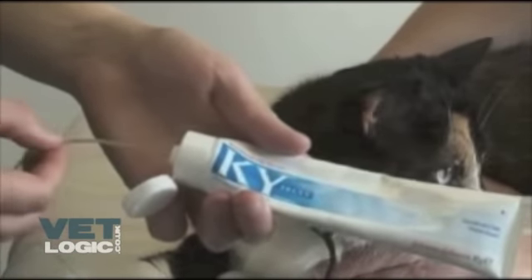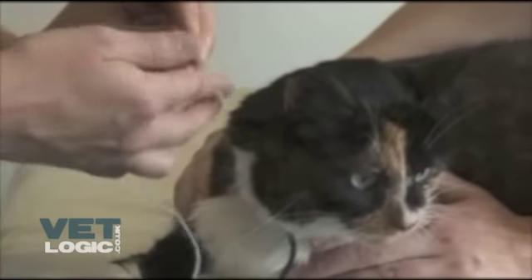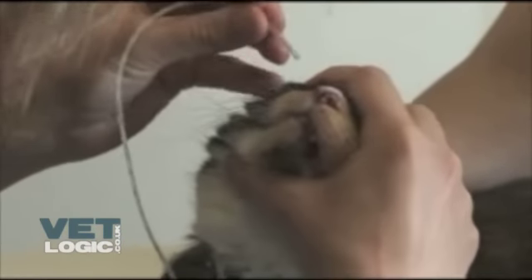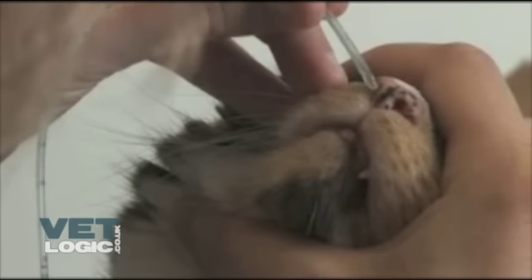The patient's head should then be held as before and the tube inserted ventrally and medially into the nose. The first couple of inches should be guided into the nose quite quickly to prevent the patient from sneezing it out. Afterwards, the rest of the tube can be fed fairly slowly with the patient's head in a natural position, allowing the patient to swallow the tube down into the esophagus.